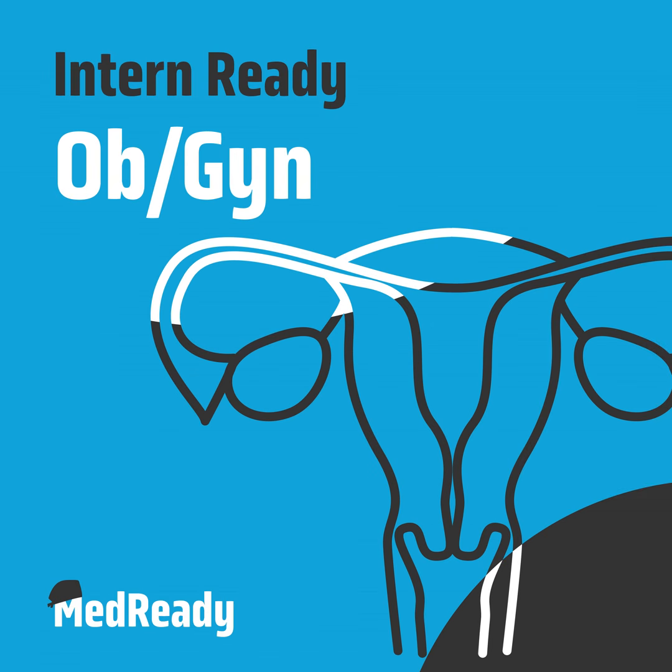But you're never going to get 100% in and out. There's always going to be some amount that goes into the belly and extravasates out. But your goal in a hysteroscopy is to try to limit that amount as much as possible. And so that deficit is the subtracted amount of fluid that is extravasating out that you're constantly keeping track of. ACOG has a maximum fluid deficit that they recommend. For isotonic solutions, it's up to 2.5 liters per ACOG.